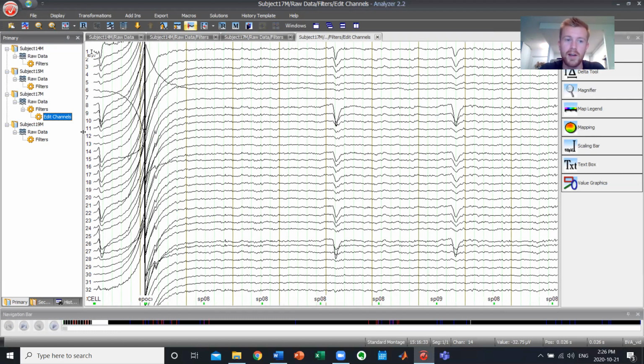And we do this so that we don't have missing channels for certain participants, so that we remain consistent when we apply things across every participant and that we have the same number of channels. And now when you remove each one of these channels, for instance, for subject 17, I removed channels 49 and 118, you're going to want to write this down, maybe keep it in an Excel sheet, so that when you write up your methods section, you can inform them that you removed a certain number of channels from a certain number of participants.